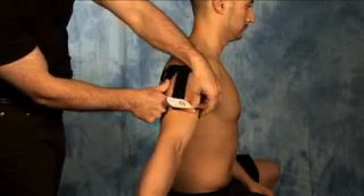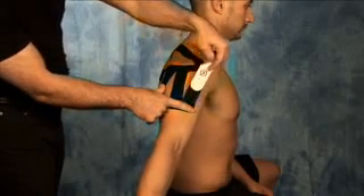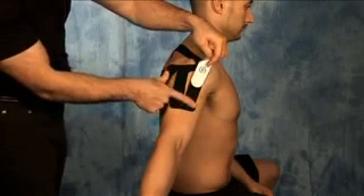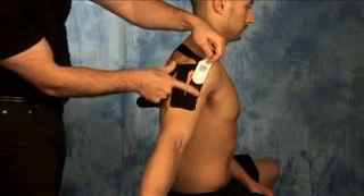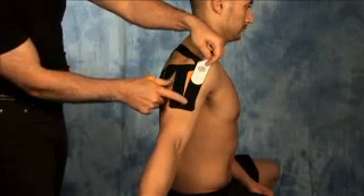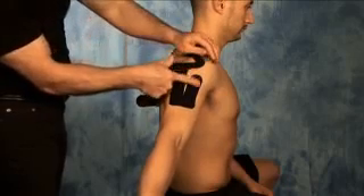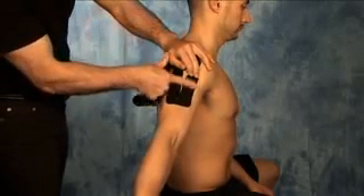Number six — peel back the backing of number six. Gently let the tape come in contact with the skin. Once the majority of that section is applied, tear the remaining portion of the backing off and adhere to the skin.